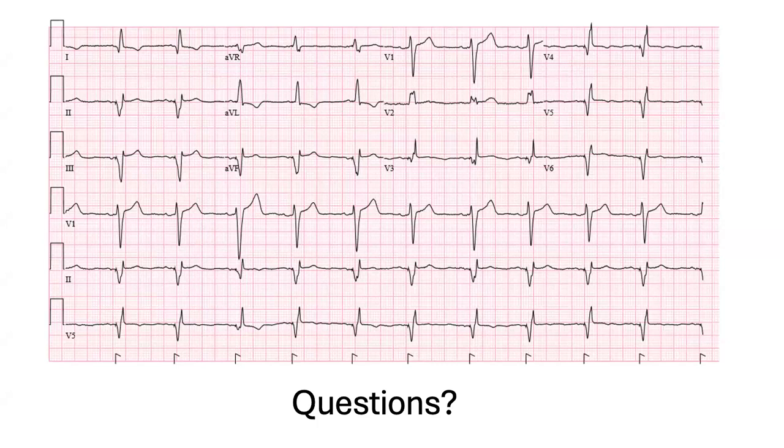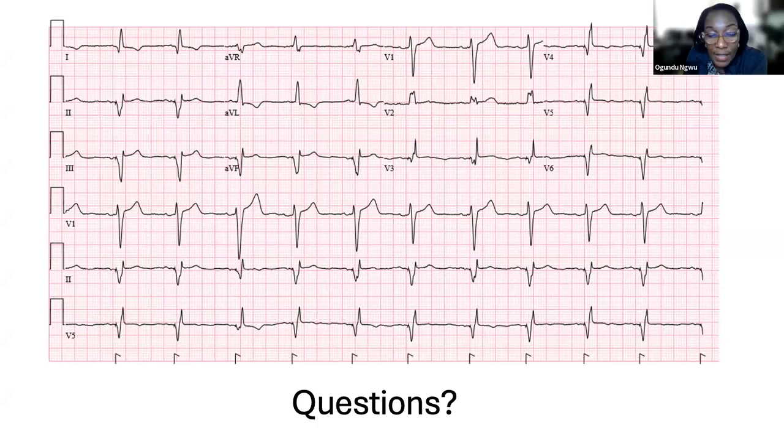It's definitely good that we have left bundle pacing as a bailout for those patients who don't have an option. But it's one of those things that you definitely have to consider. And I do have a couple of patients.